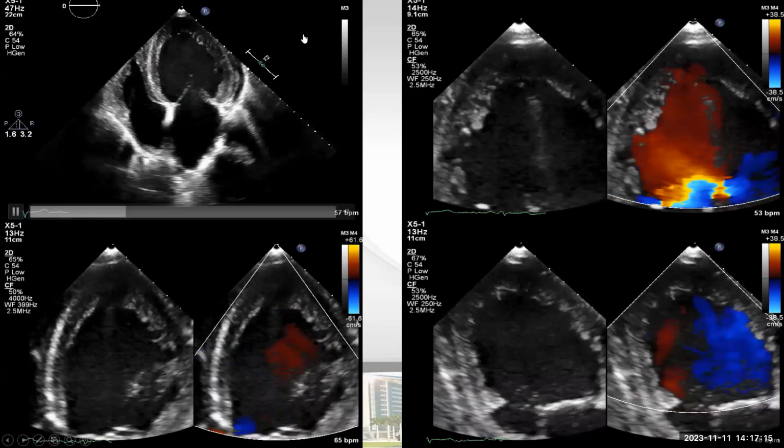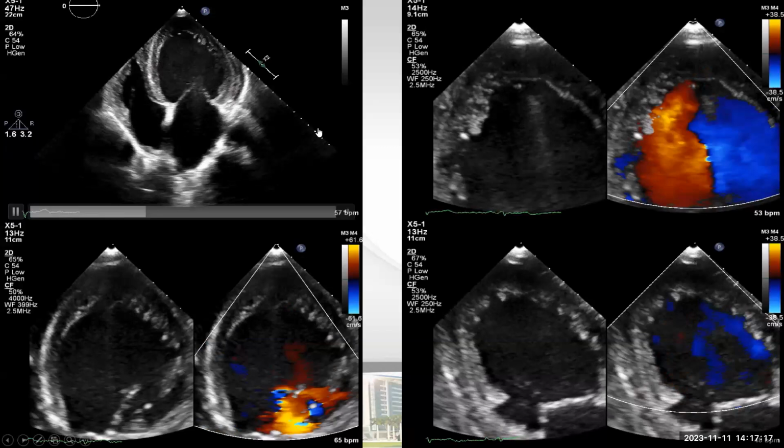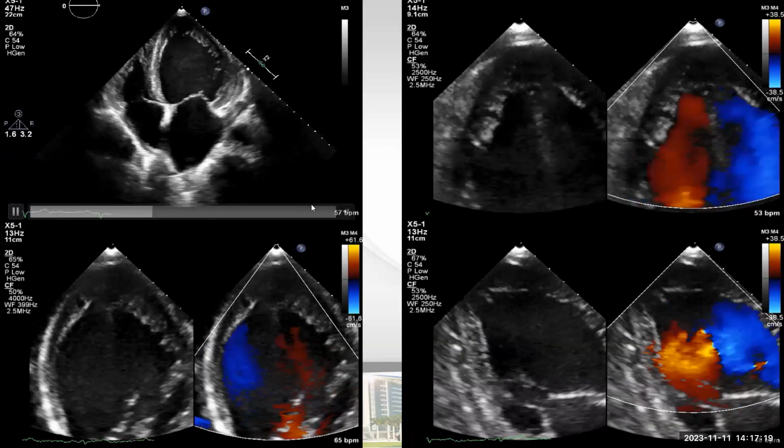However, there are many definitions. Yes, you said you need contrast or MRI to assess the ratio. That's right, this is the criteria which I mentioned now. There are definite criteria. However, in the echo quiz, nobody will ask you about criteria. In a quiz, they just bring a typical feature of echo. To confirm, you need cardiac MRI and contrast. As I said, you will have the same finding as with color, but more clear, as the contrast will invade all the recesses.